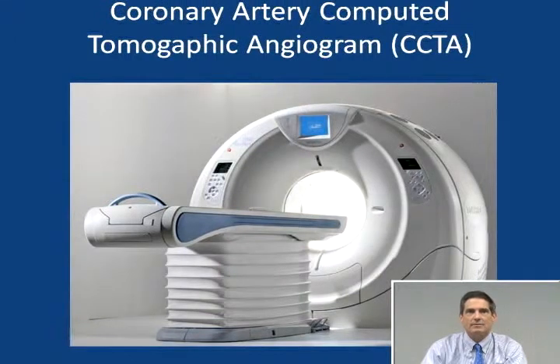How about CCTA, or coronary computed tomographic angiography? Again, this is performed with EKG and IV contrast, and this is really undergoing a rapid evolution.